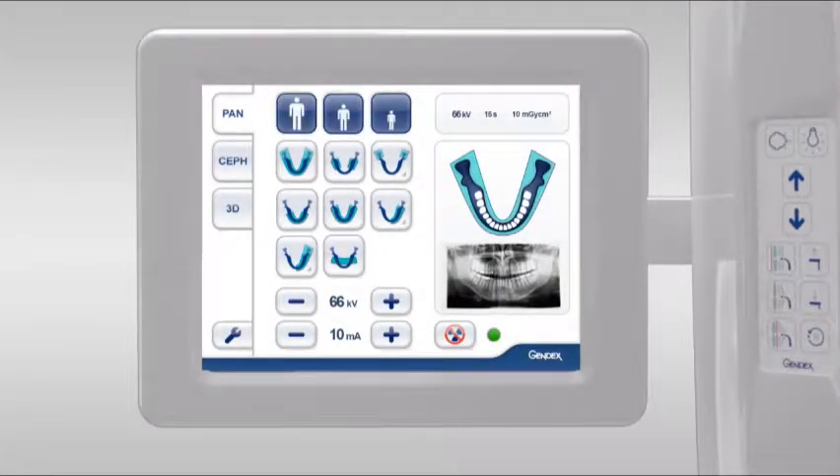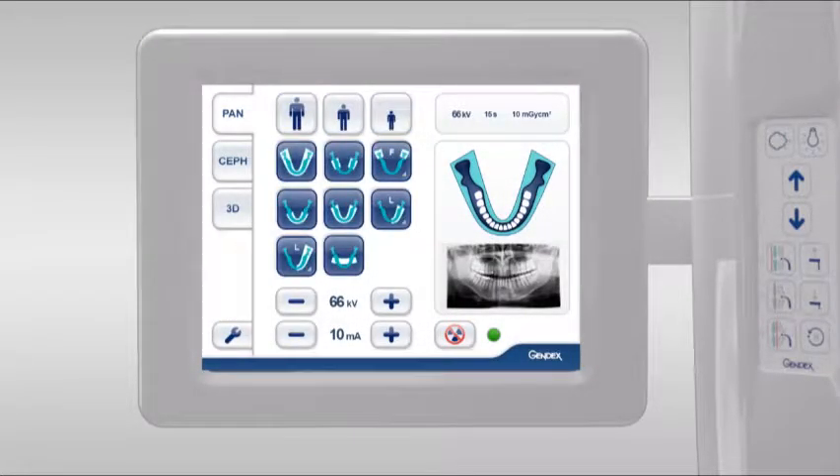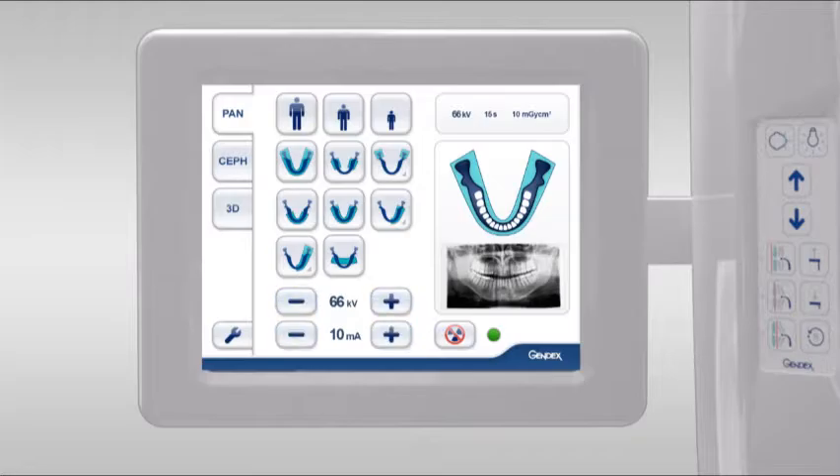The touch screen selections include body size, projection types, kilovolt and milliamp control, and a no dose simulation. Displayed are system status, patient and dose information, as well as graphic and clinical examples of the selected projection.